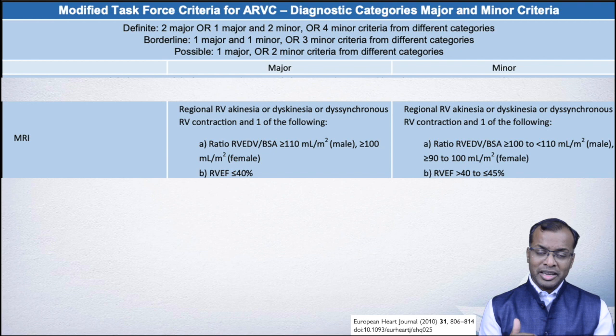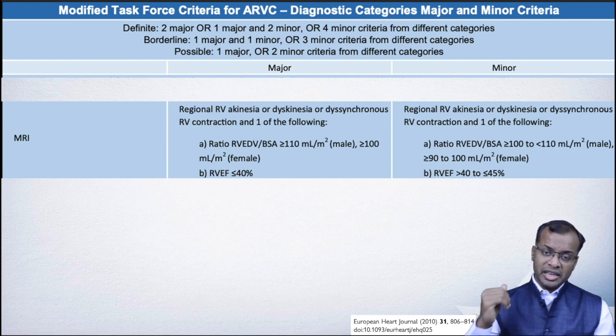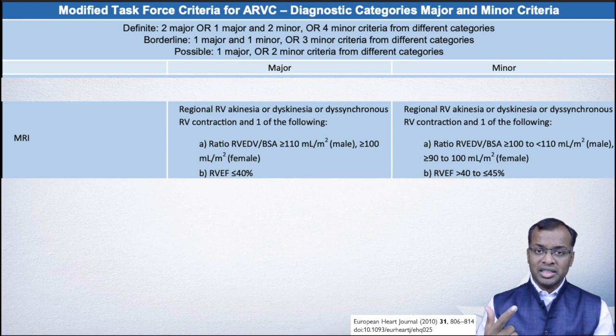In our real life practice, we see classical cases which appear like ARVC on MRI, but they do not match up to the diagnostic criteria if there are no other features: if there are no ECG abnormalities, if there is no histopathology confirmation, if there is no family history or no rhythm abnormalities which satisfy other criteria, we cannot make that diagnosis on MRI.